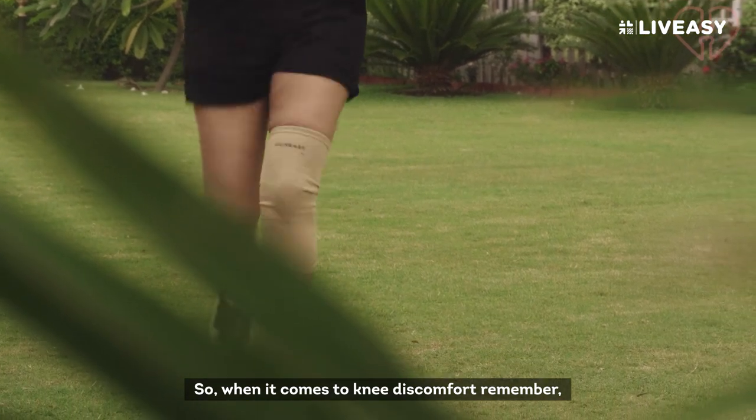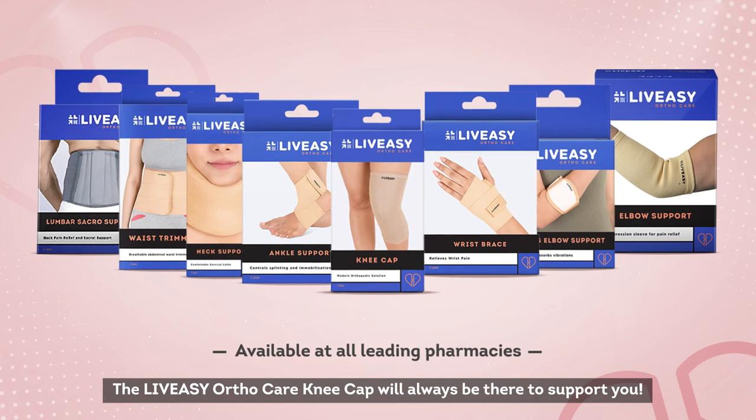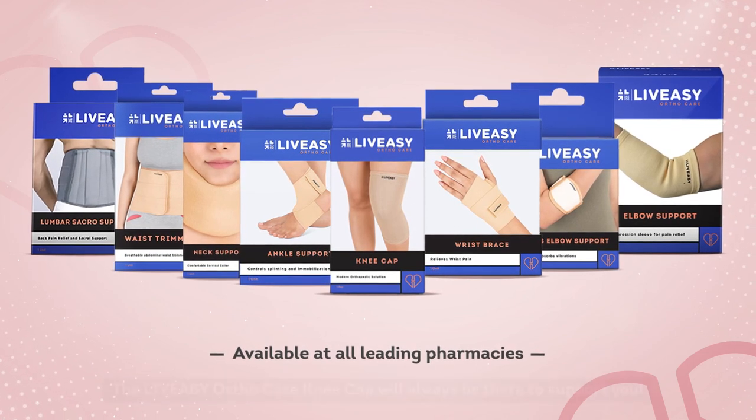So, when it comes to knee discomfort, remember, the LiveEasy orthocare kneecap will always be there to support you.